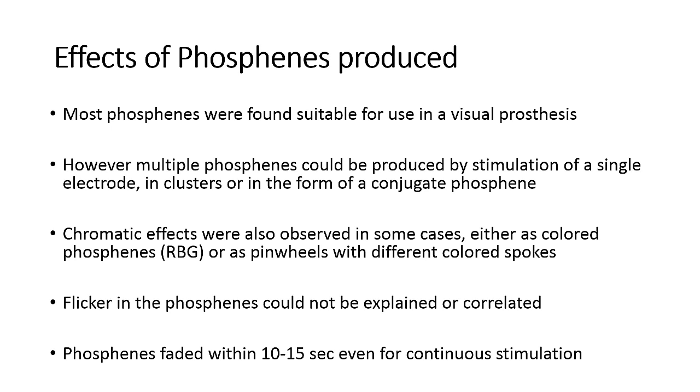Hence, these differences in findings are explained by the differences in the conditions resulting in blindness in the patients in both the studies, and also the different methods used. In the case of an actual visual prosthesis, in the case of Dr. Brindley and Dr. Lewin, the prosthesis was affecting a different part of the visual cortex as opposed to Dr. Dobell.